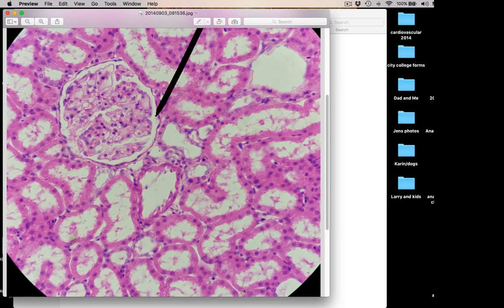Here's the epithelial tissue. This is one layer thick. Squashed nuclei. See it going all the way around here? This is simple squamous. One layer thick, squashed nuclei. There's going to be lots of simple cuboidal in this slide too, but for now we're just concentrating on this simple squamous right here.